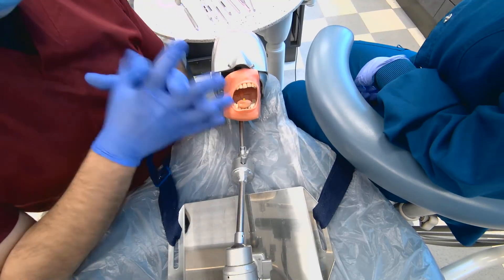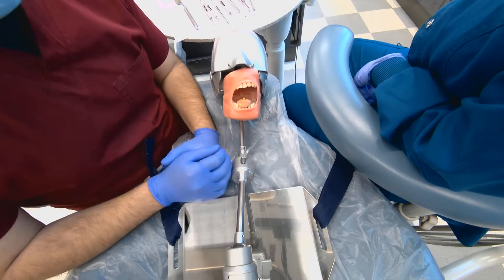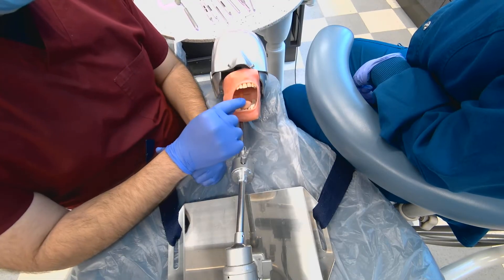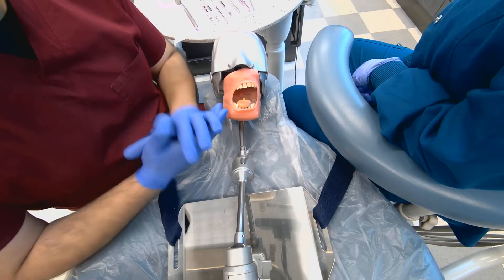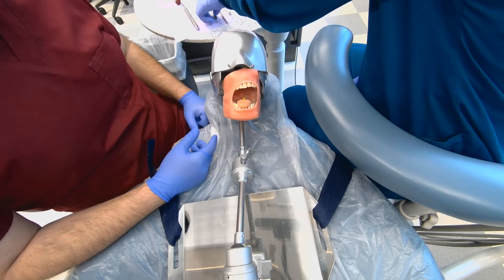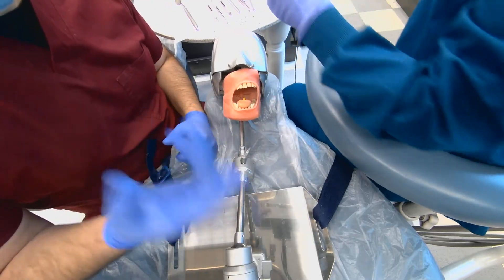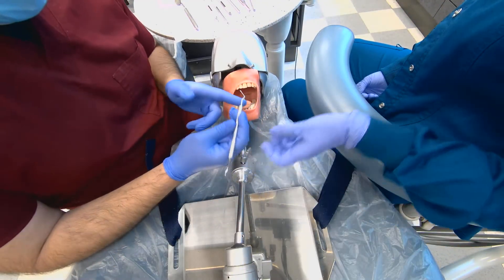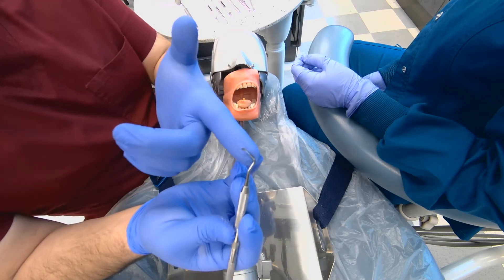We definitely have to know the patient first, and then we do the first step, which is the access opening — drilling the tooth all the way until we get to the pulp chamber. Once we get to the pulp chamber, we have to start by removing the debris from the pulp chamber using the endo spoon that you see here.